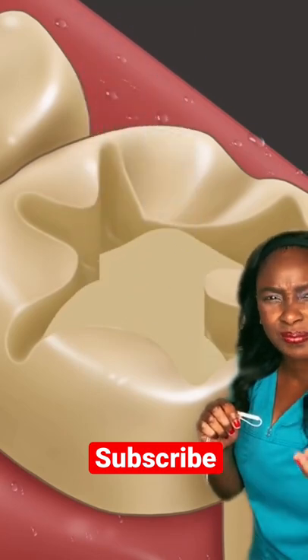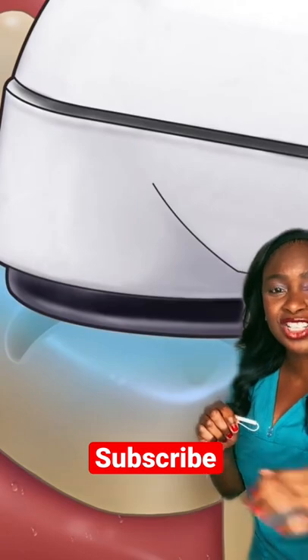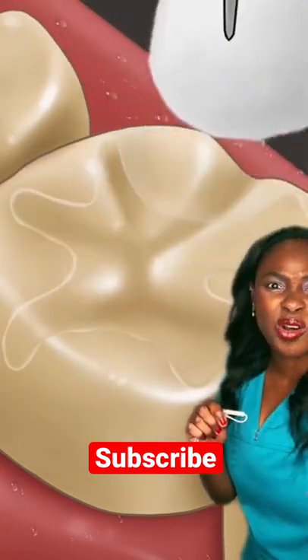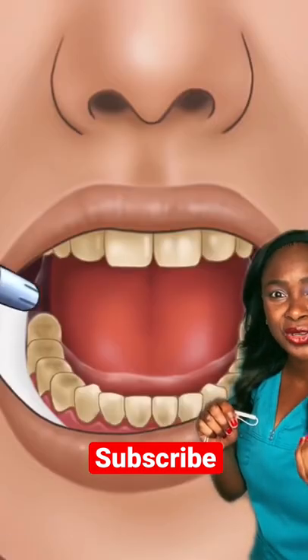Then they're going to put a little base because it's a deep filling, and they're using little explorer instruments to just seat that there nicely. Then they put a porcelain restoration or an indirect restoration on that. They should check the bite, and of course they're curing it to make sure it seals.